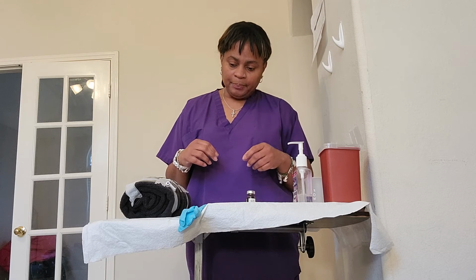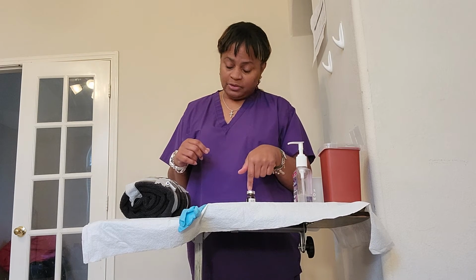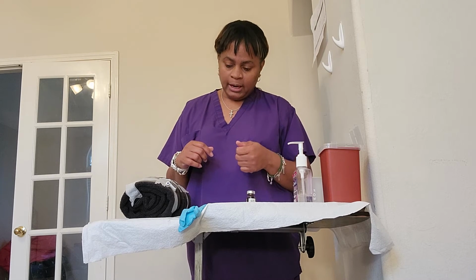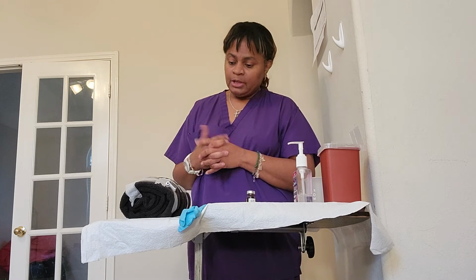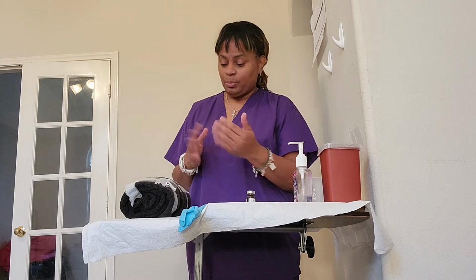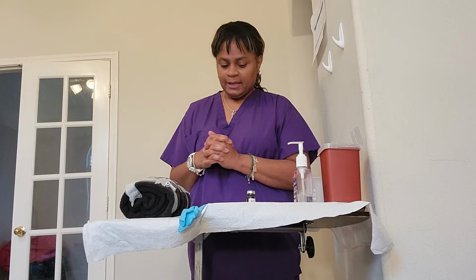After I've done that, I will put another 3 mLs of the saline in, and I'll push that through slowly. Then I'll clean the hub once more, and then I will just see how you're doing in regards to the medication, and then we'll be done. Actually, I'm going to assess it again once more afterwards, and then we'll be finished. Do you have any questions for me? Great, let's begin.